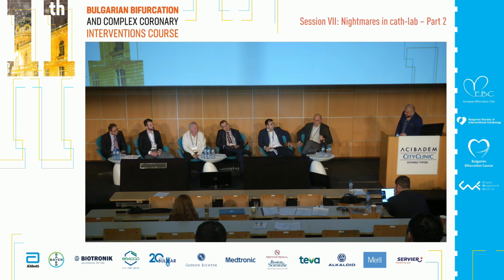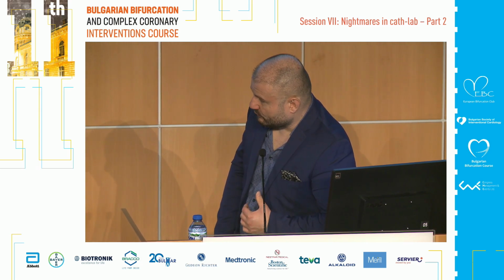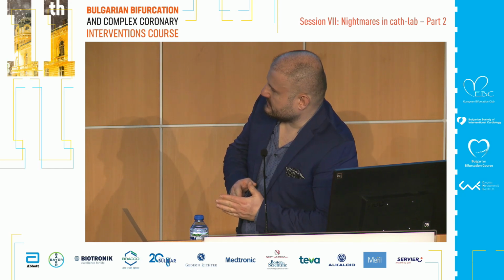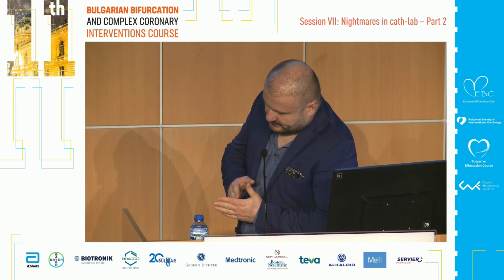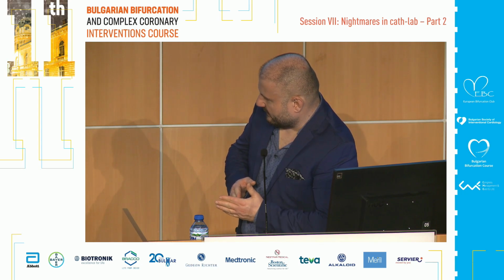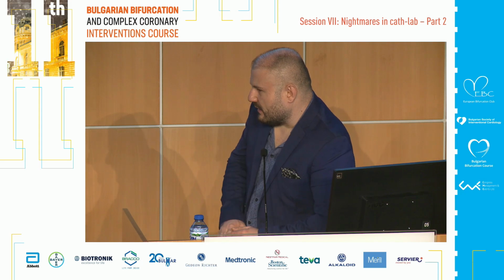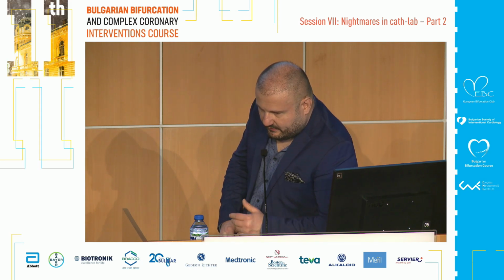I didn't show the movie from the previous intervention, when the ostial LAD stenosis was very tight, 90%. When we did that procedure, we also had a balloon parked in the circumflex, to be sure that we would cover the ostium of the LAD. So we were pretty sure that we covered it, but we didn't want to leave the LAD only on IVUS assessment because the stenosis of the LAD 1 month before was very tight.